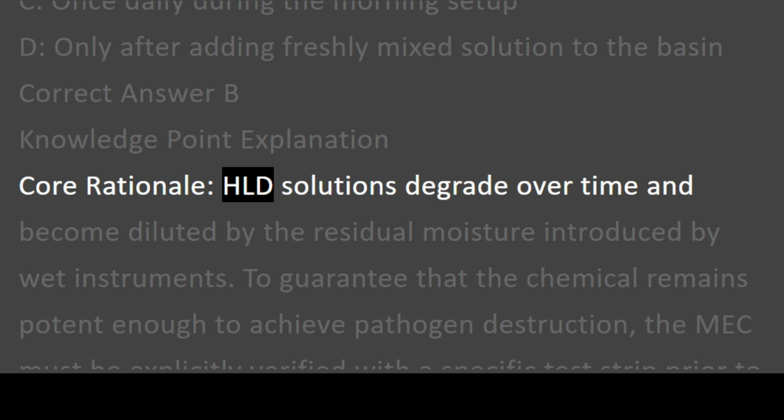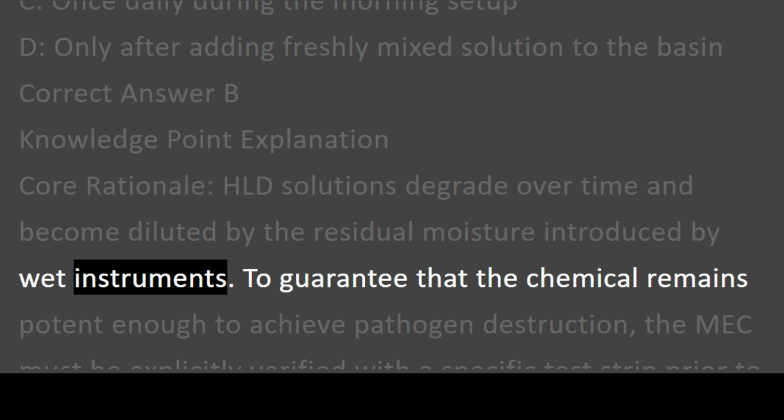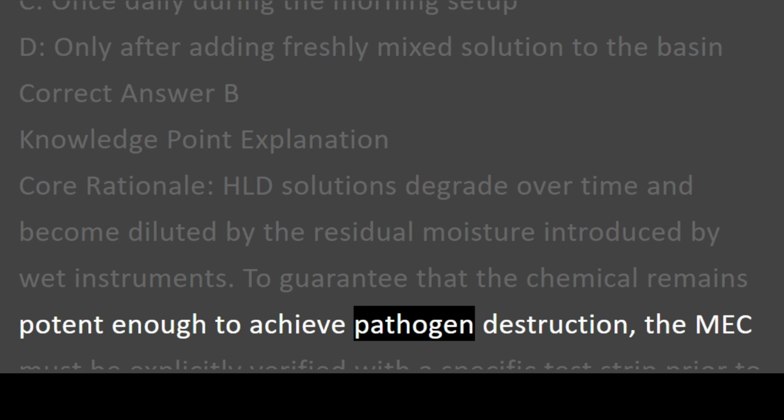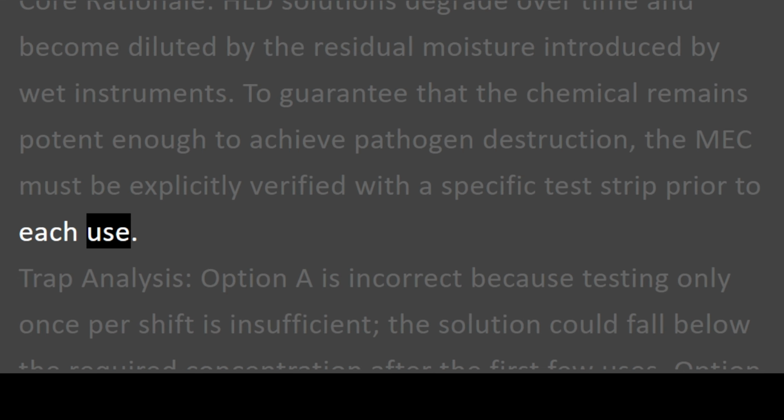Knowledge point explanation. Core rationale. HLD solutions degrade over time and become diluted by the residual moisture introduced by wet instruments. To guarantee that the chemical remains potent enough to achieve pathogen destruction, the MEC must be explicitly verified with a specific test strip prior to each use.